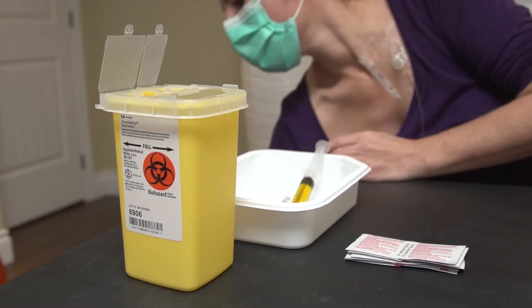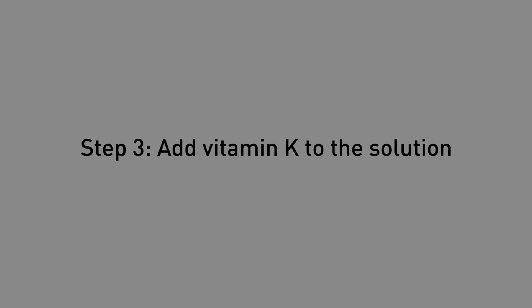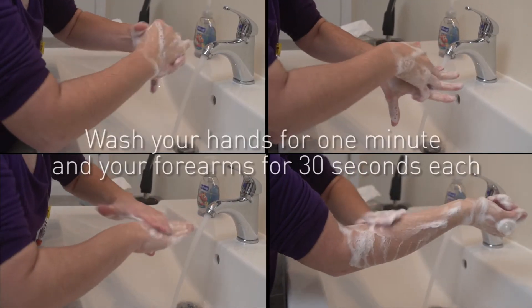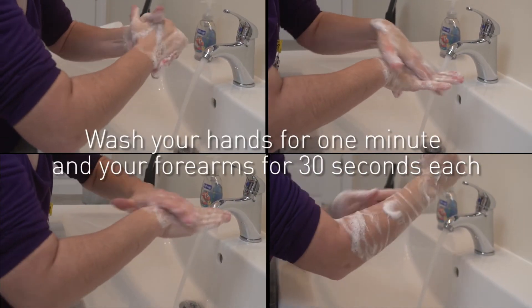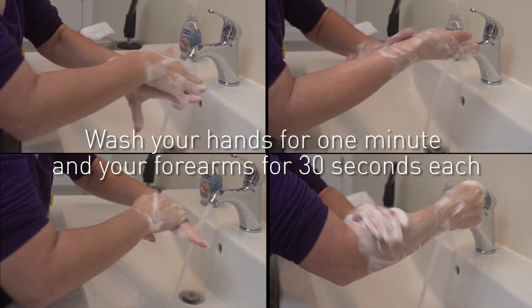Discard the ampoule and its top in the biohazard container. Once you are finished drawing the multivitamins and the vitamin K, you can add them to the nutrition solution. Proceed as follows: before you begin, it is essential that you wash your hands for one minute and your forearms for 30 seconds each, as explained in module 2.